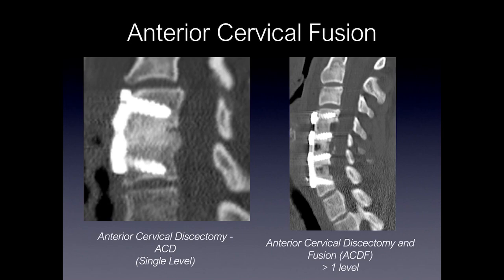Here's an example on the left of a single-level anterior cervical disc fusion, where there has been a discectomy and a fusion across the disc base with an anterior plate and vertebral body screws. And here's an example of a multi-level anterior cervical disc discectomy and fusion, where the discs have been removed, implants have been placed, and a plate is seen spanning multiple levels with vertebral screws.